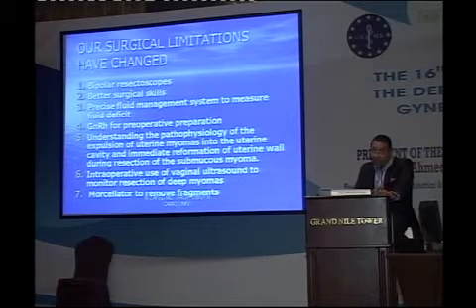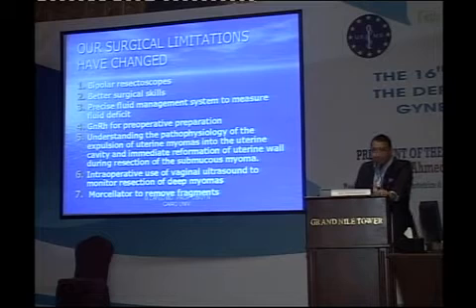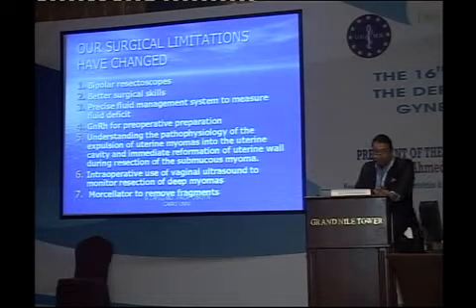The surgical limitations have actually been changing with the evolution of new technology. We have now the bipolar resectoscope. We have better surgical experience. We have a precise fluid management system to measure the fluid deficit. We also have the ability to use GnRH for those patients who need preoperative medication.